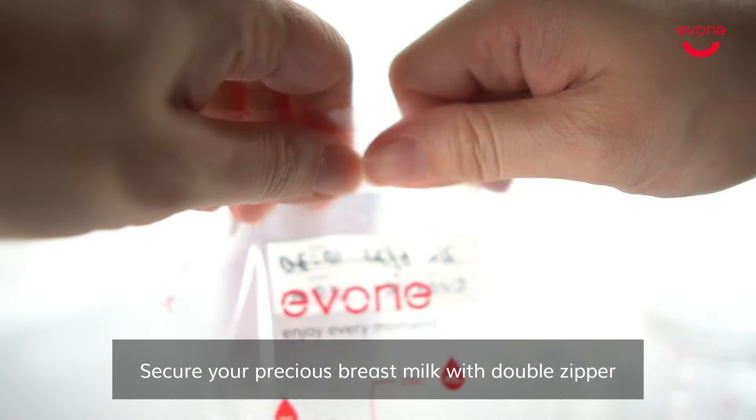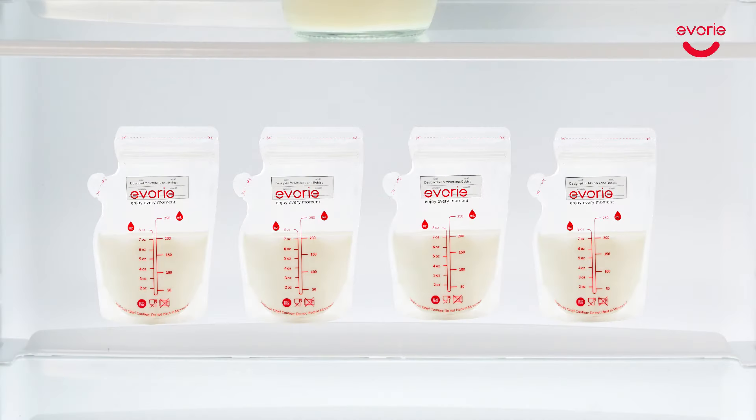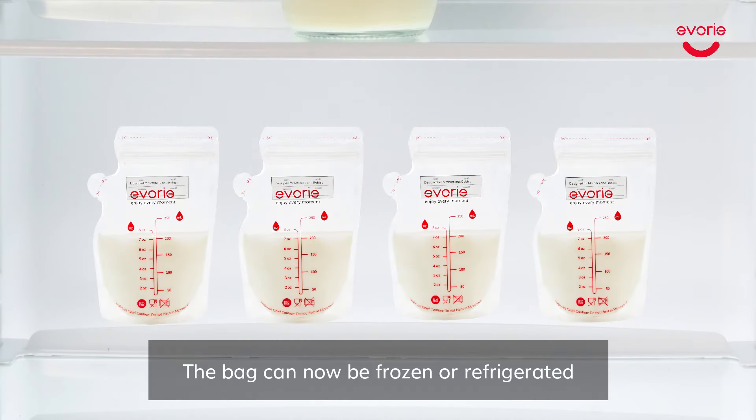Secure your precious breast milk with the double zipper. Slowly compress the air out of the bag. The bag can now be frozen or refrigerated.